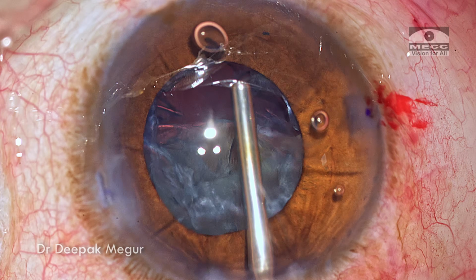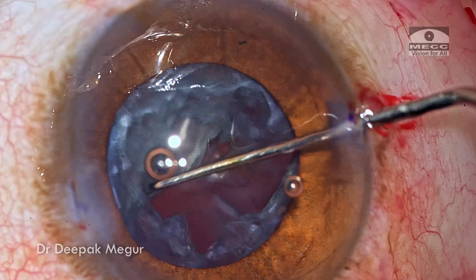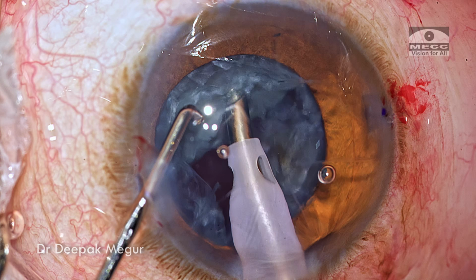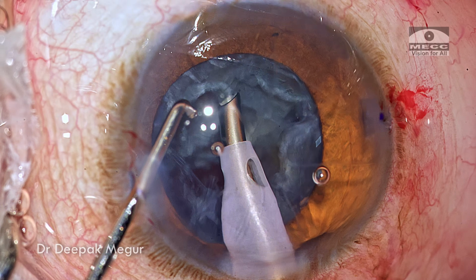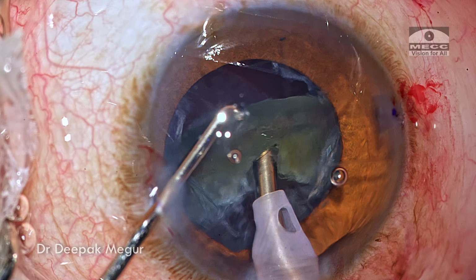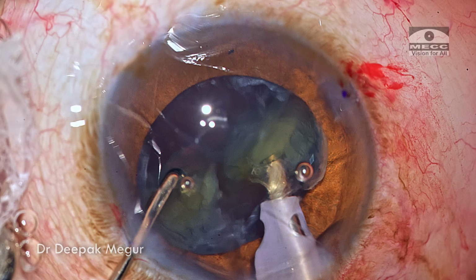The chamber is refilled with viscoelastic. The nucleus is rotated so that it becomes more accessible. One can see that it's difficult to engage the nucleus because of its softness. Nevertheless, using extremely low power, I could just get hold of the nucleus, pull it out of the bag, and it was chopped to divide into two smaller fragments.